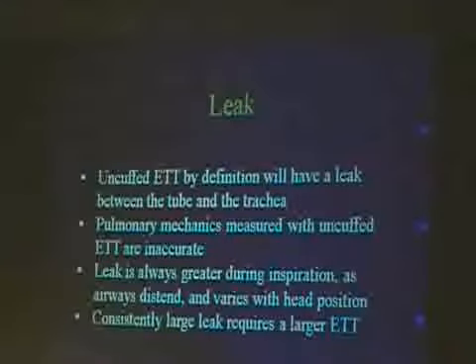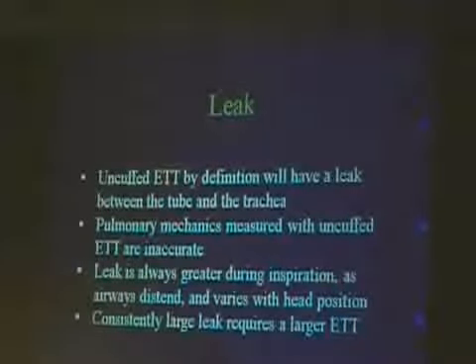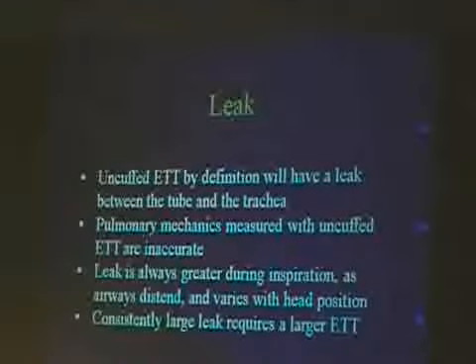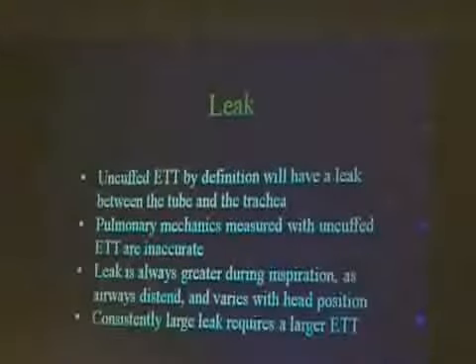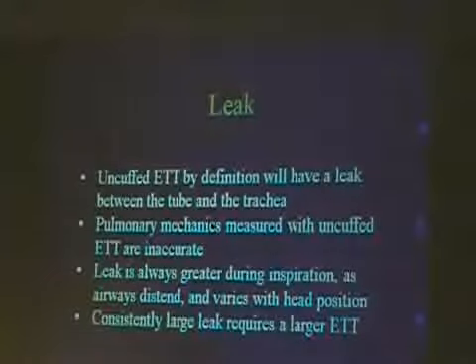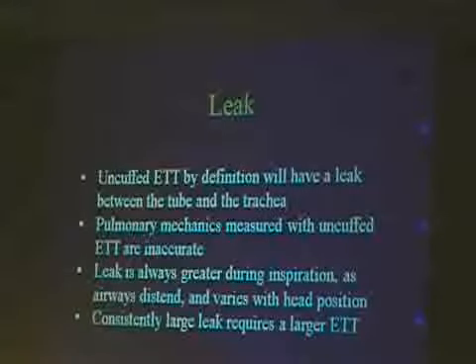There are certain things you can do to minimize the leak. You can look at trends, provided that your leak is minimal, but you can't use them as absolutes. So that's an important thing to realize. Also remember that your leak is always greater on inspiration, because as the airways distend, there's going to be more leak. That's why we use expiratory tidal volume, because that's minimal leak.